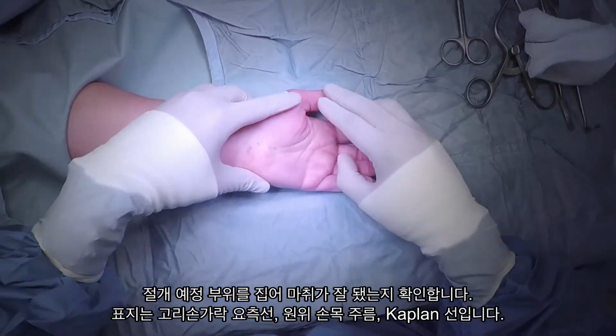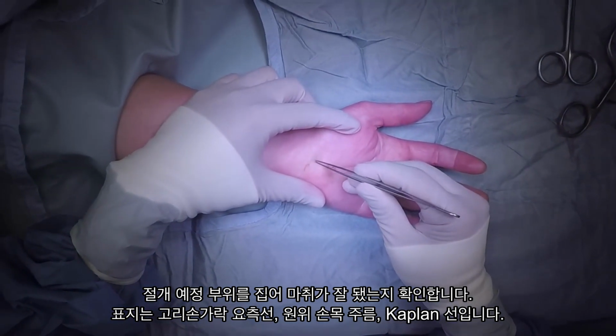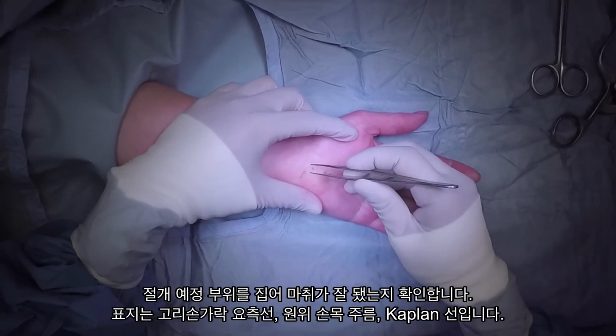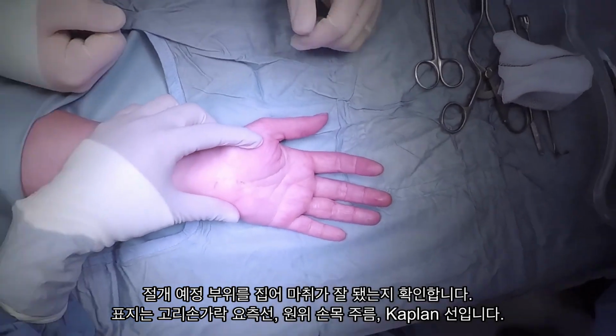Your block should have worked by now, so check the anaesthesia before you start by pinching the skin over your proposed incision with some toothed forceps. Remember, the patients can often feel movement or pressure, but shouldn't feel any pain. If that's fine, then you're good to go.